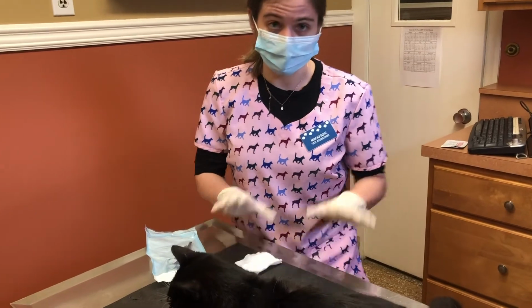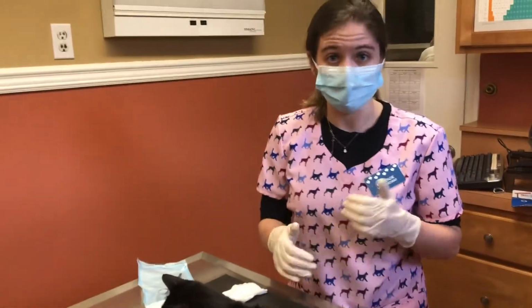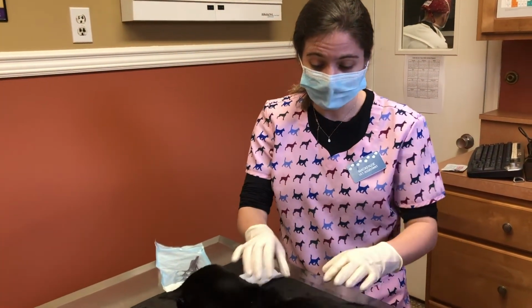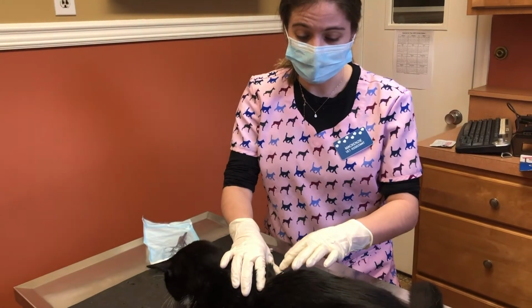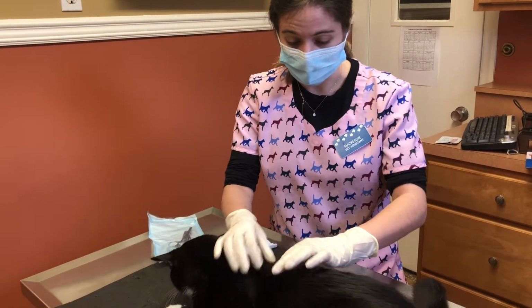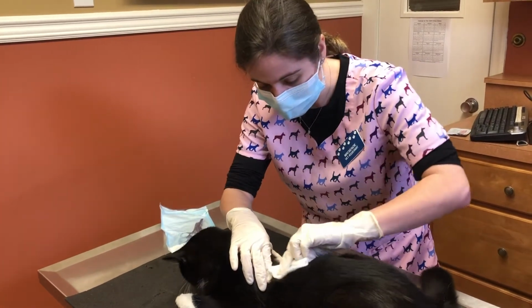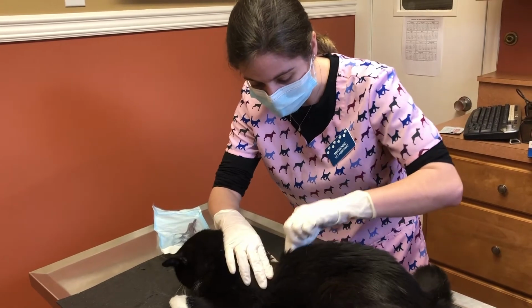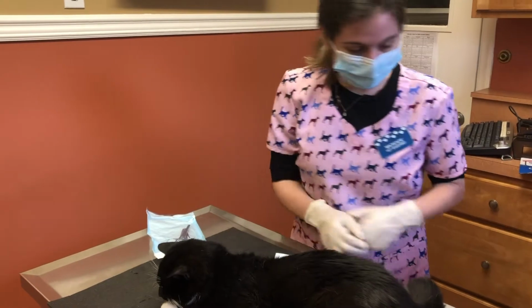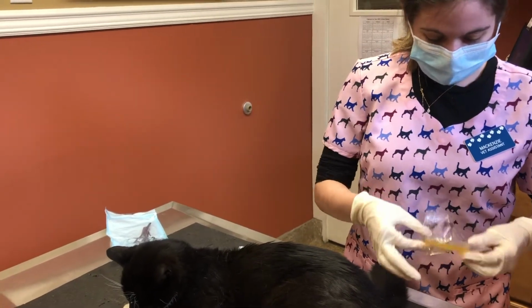So first thing I'm going to do is look for a spot. This cat doesn't have any dermatological issue, but if he did, I would be looking for an active lesion, and I'd be looking on the periphery of it for any broken hair shafts and scaly skin. So this is the spot we're going to be using here, and I'm going to clean it with soap and water to make sure that there's no contamination. And I'm going to open my DTM.